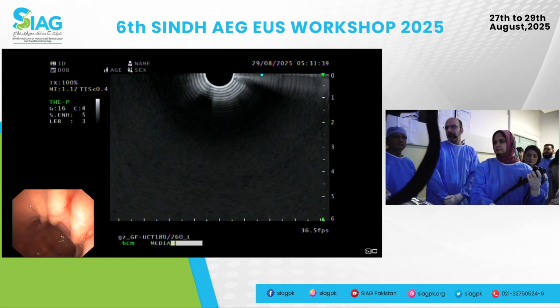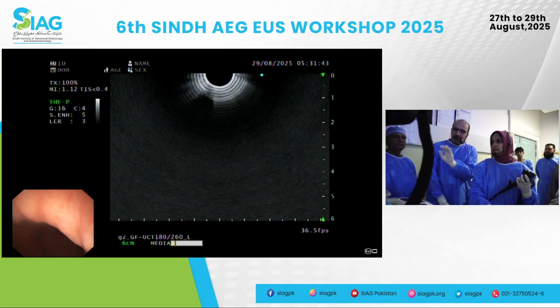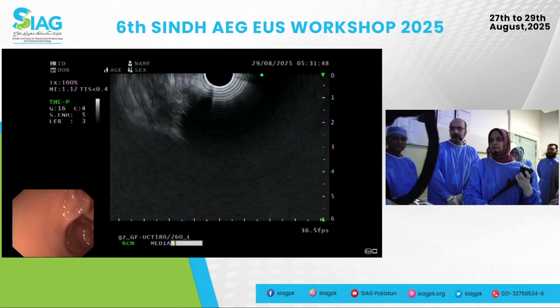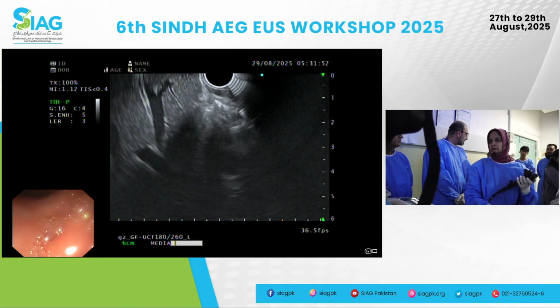Okay, so now, moving on to the duodenum. Yes, go ahead and move on. I think you could see the duct. You could try and follow it further down towards the neck, but it's okay for now. In the interest of time, why don't we do the duodenal exam? So what is the purpose of this exam? Just for evaluation of pancreatitis?